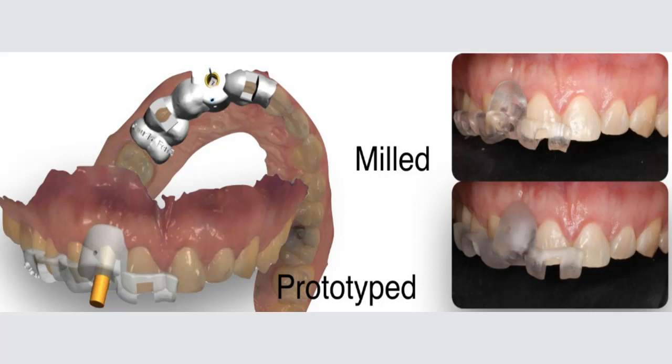This differentiates them, which means if you have an STL designed for printing, can you mill it? Well, you can mill it, but you're not going to have the more precise information for the milling if you have designed that one for milling alone. So this is really important.